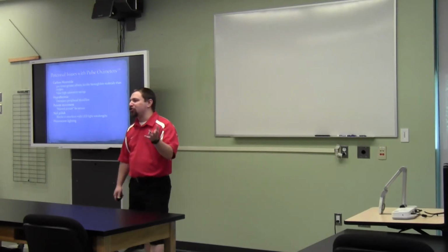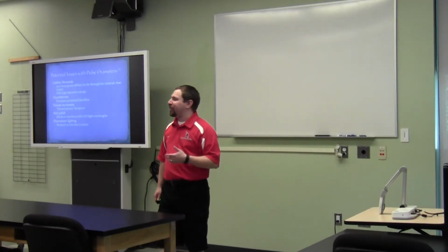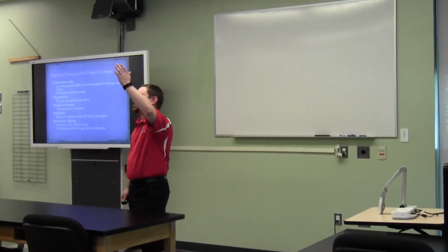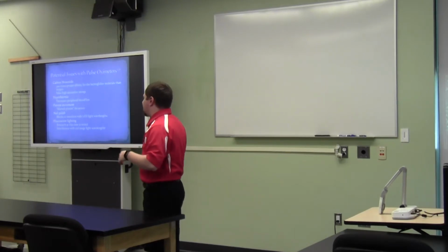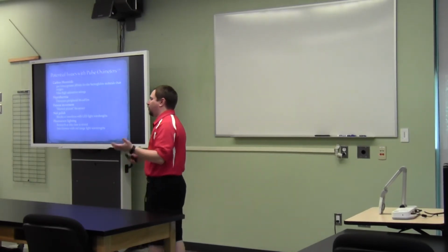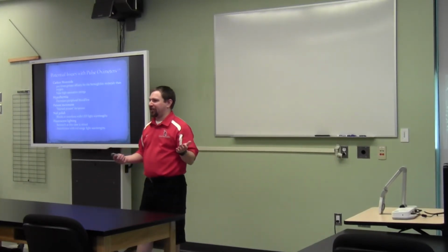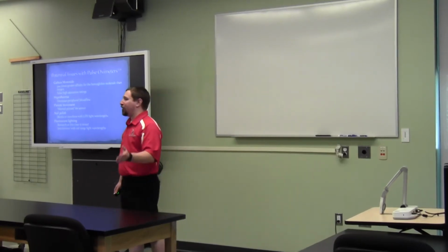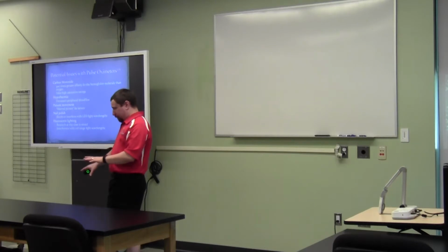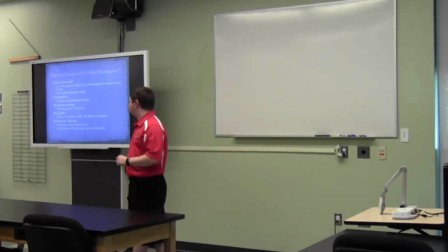Fluorescent lighting. Okay, research is a little mixed about this one. It's been going around and around for about 10, 15 years now of whether it is the case. The feeling is that lighting like this, because it's fluorescent, interferes with the red wavelength of light, and then you're not sure what the pulse oximeter is picking up. So for me personally, if I'm outside or doing that, I'll throw a towel over the hand. That way I know it's dark and I know that thing is getting a nice clean reading. Quick, simple, and easy way to adjust for it.